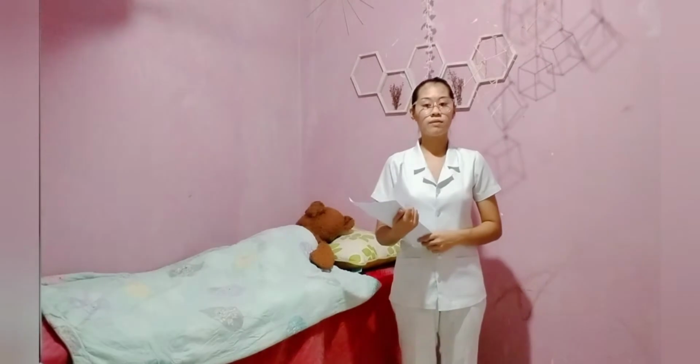So, after explaining the procedure, we have to provide privacy. This can be done by closing the door or windows to provide the client's integrity, and position the patient in a dorsal recumbent position with the knees flexed. This is to provide comfort to the patient.